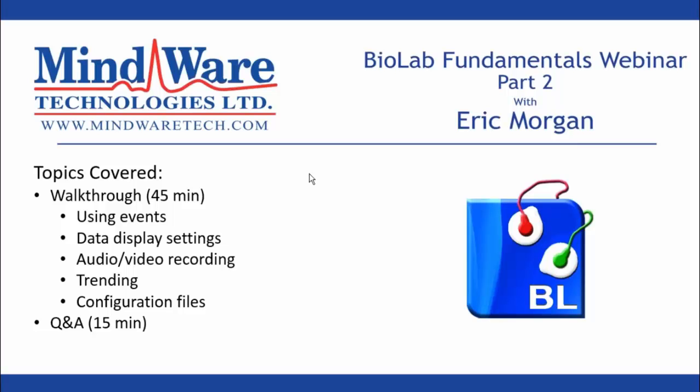So as usual, the webinar is going to be split into two main parts. We're going to have a walkthrough, and we're going to have a question and answer portion. The walkthrough is going to cover the remaining topics of configuring BioLab, such as using events, displaying data in BioLab, acquiring audio video, trending, and using configuration files.